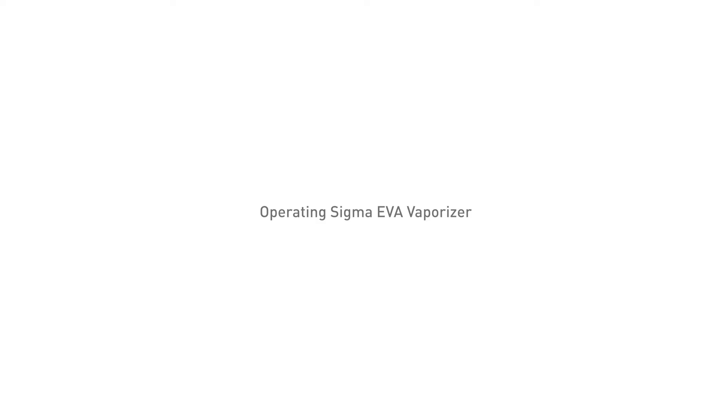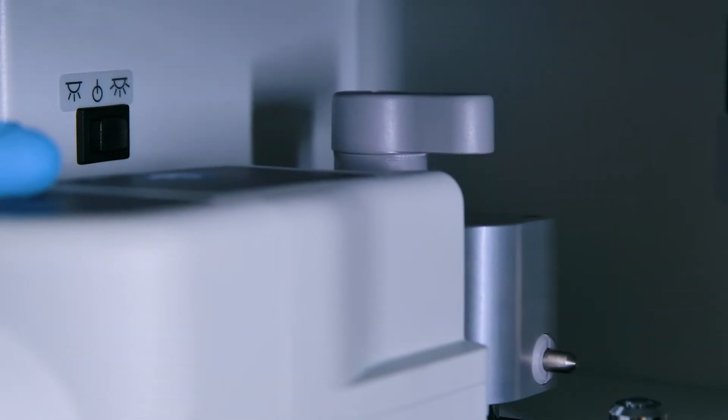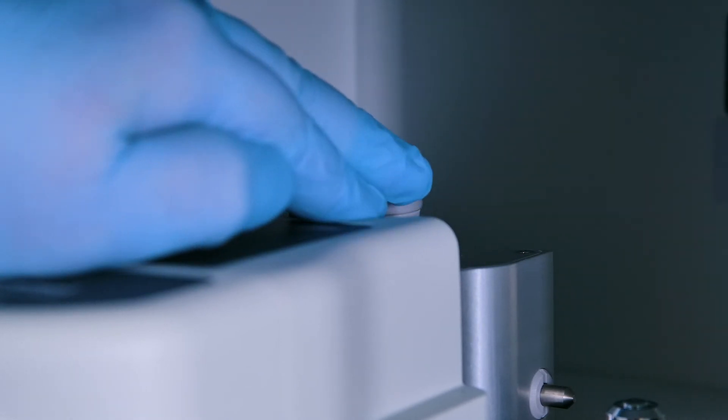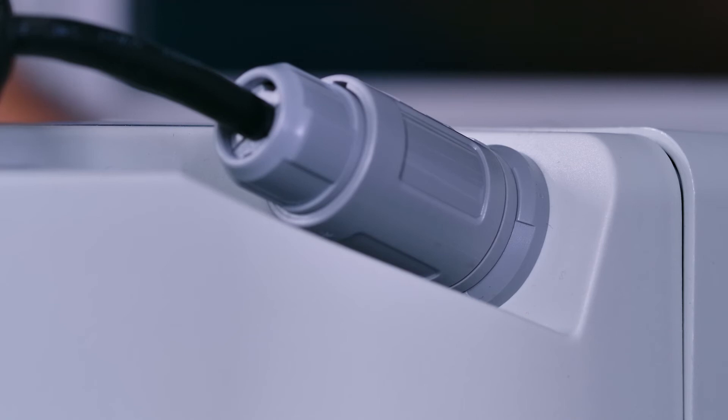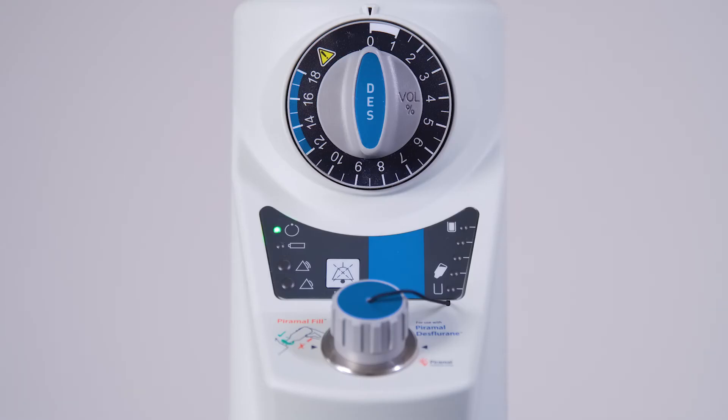Operating Sigma EVA Vaporizer. Check that the vaporizer is fitted correctly to the anesthetic machine. Connect the electrical power supply cable to the socket on the vaporizer top assembly. Perform a self-validation check. All indicators will flash, accompanied by a repeated single audio tone.